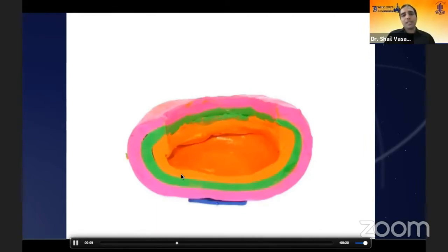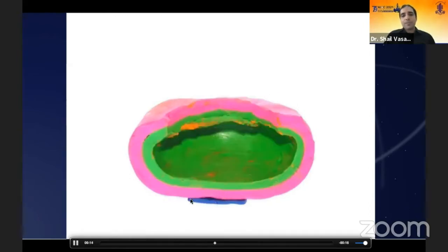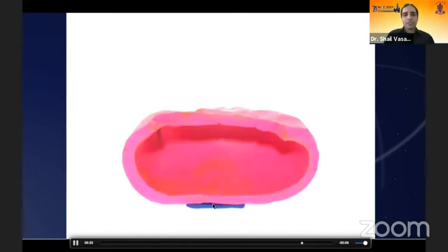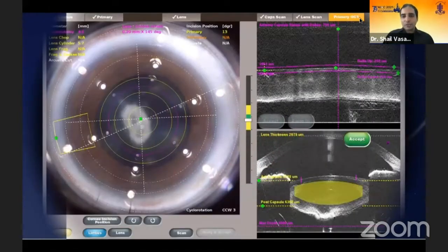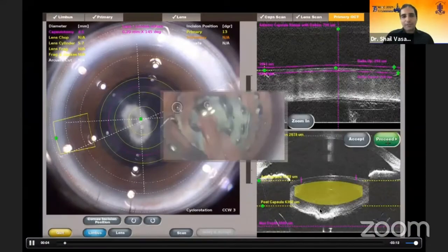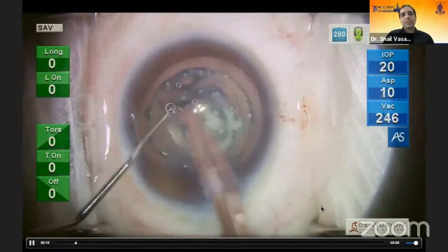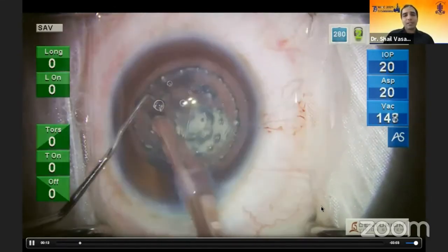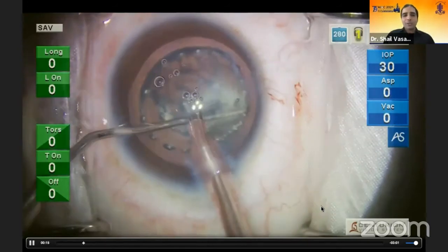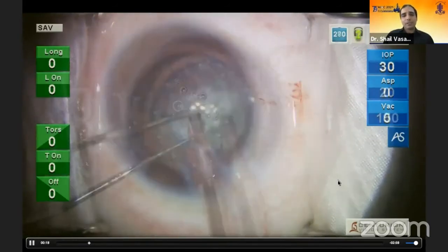Rupture rates dropped from 7-8% with inside-out delineation to about 4% with the femtosecond delineation technique. This animation, created by my colleague Dr. Samarish, shows that the cylindrical lens division patterns act as cushions — you remove each piece from the support of the other, so until the last epinuclear plate is removed, there is constant support to the posterior polar cataract.